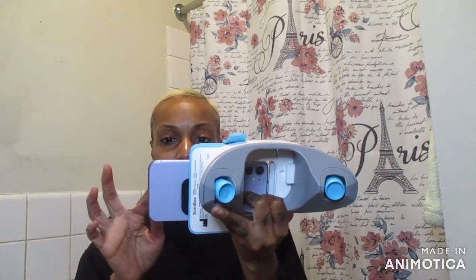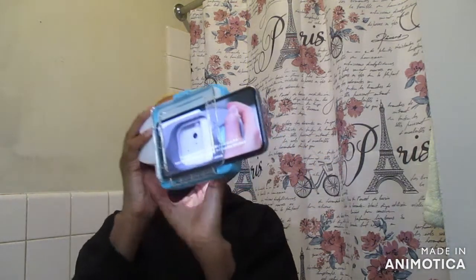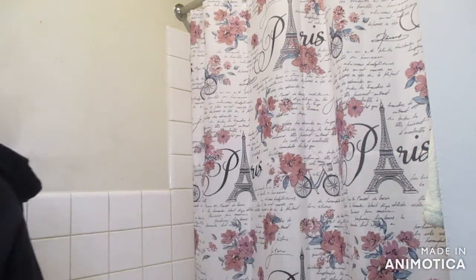So innovative. During the scan — place your phone into the scan box and latch it in. Insert the cheek retractor and snap the scan box into place. Double tap to continue. These magnets are going to hook up to these, and then you'll see how I do my scan. It's going to look real weird, okay? I'm only doing this for y'all because y'all are my family, my folks, my audience. I'm embarrassed to be doing this in front of y'all, but hey. Double tap to continue. And then you just snap it on.